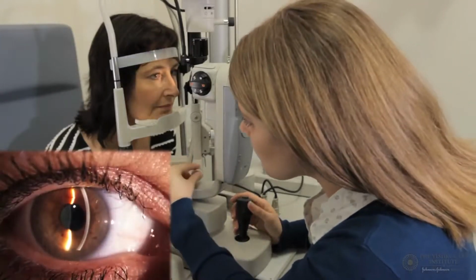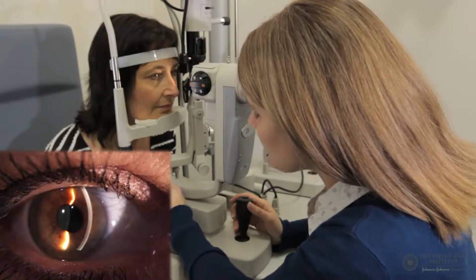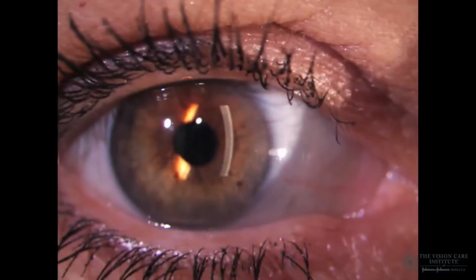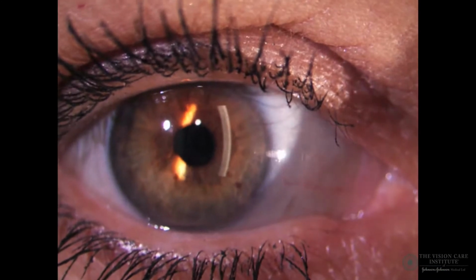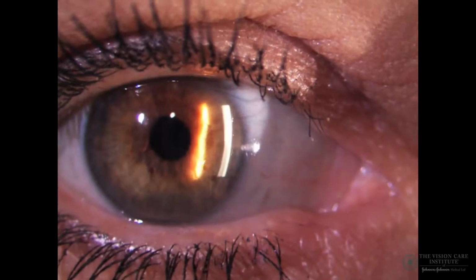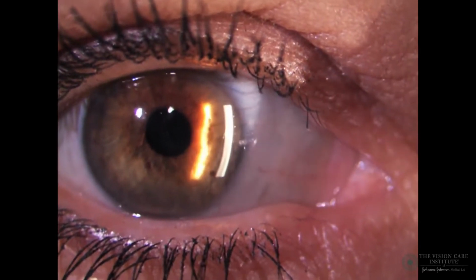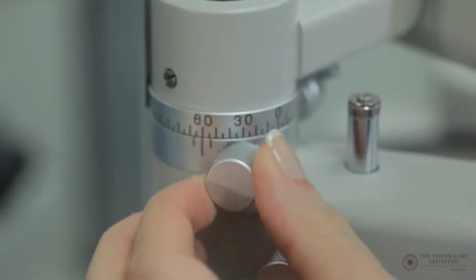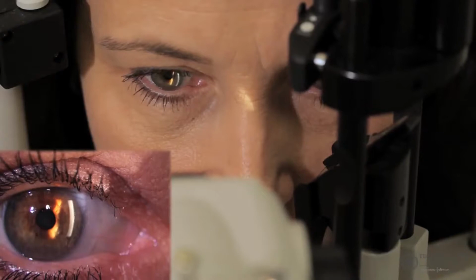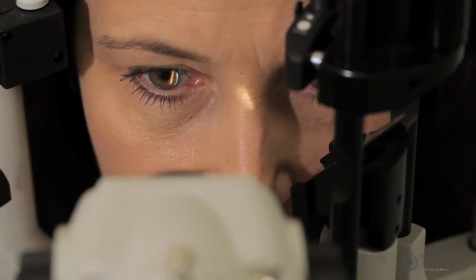The placement of the iris in the eye is seldom symmetrical. For this reason, it is important to assess the nasal as well as the temporal angle. In principle, this is conducted in the same manner as the temporal angle. Just as we did with the temporal side, we form a sharp corneal section of about 3 to 4 millimeters in height, and then ensure that the angle between the observation and illumination system is set to 60 degrees, locking it once again to avoid any changes.